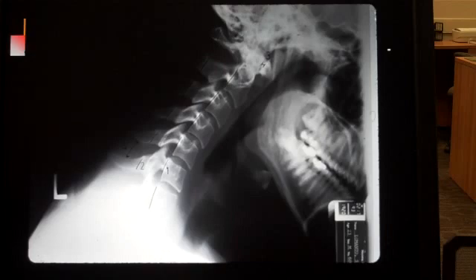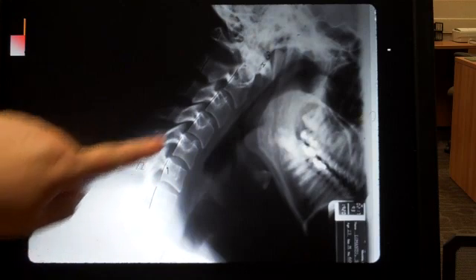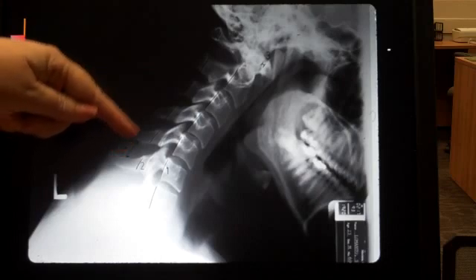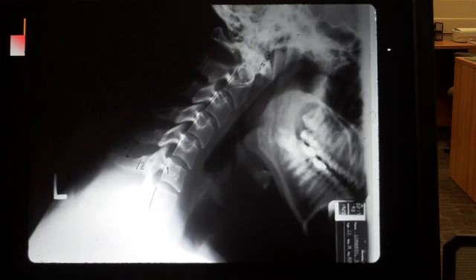So we are working on a lateral flexion view, and again, we have four things: George's line, the posterior cervical line, the ADI, and the interspinous spacing, where we want to see an equal gap between these spinous processes.